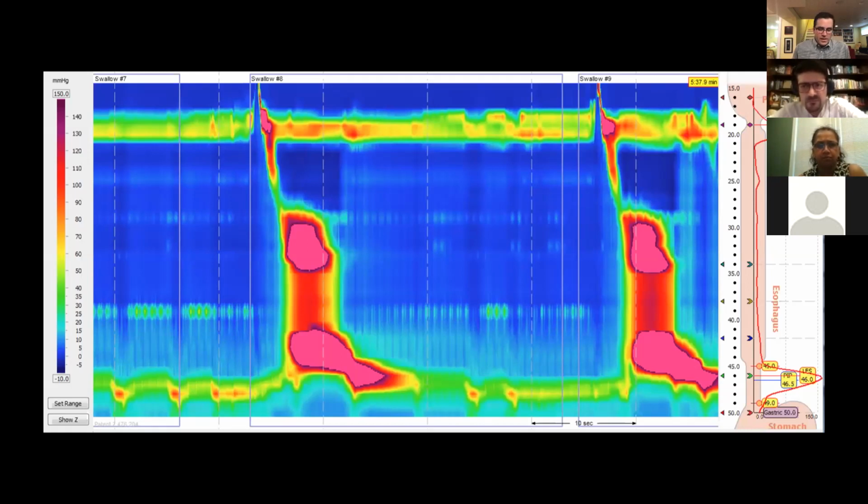And then actually, Dr. Yates texted me a question for you to ask: if you see changes in esophageal body contractility in type 1 and type 2 achalasia, like the picture you showed from type 3 achalasia. No, I'd say you just see aperistalsis.